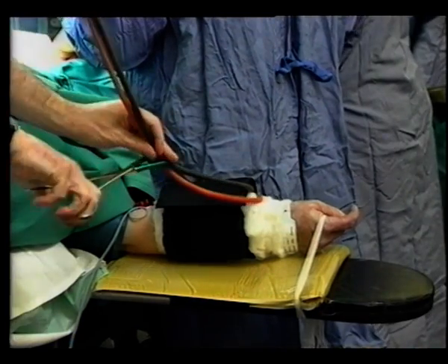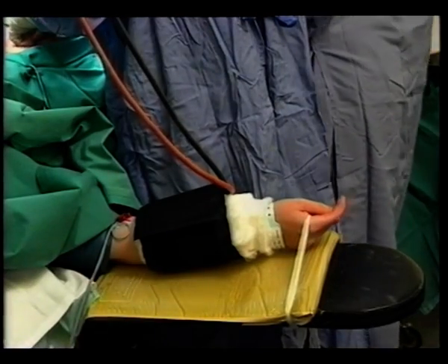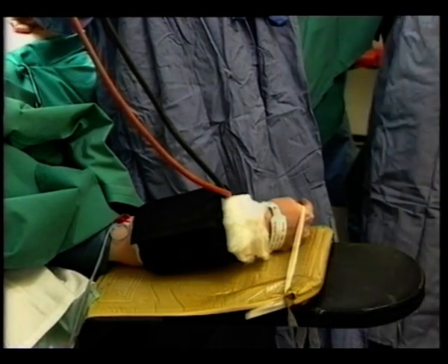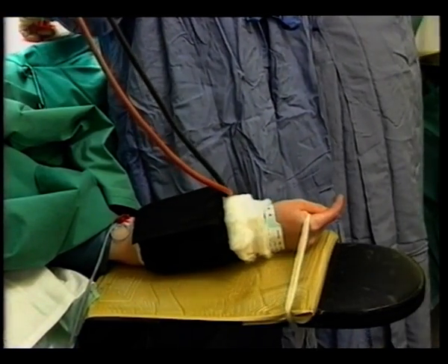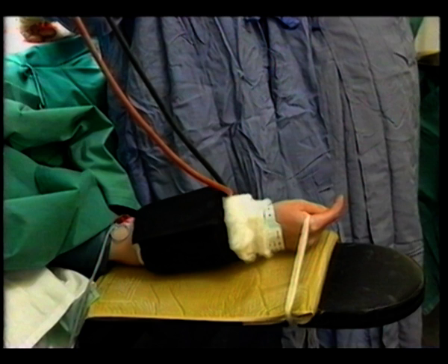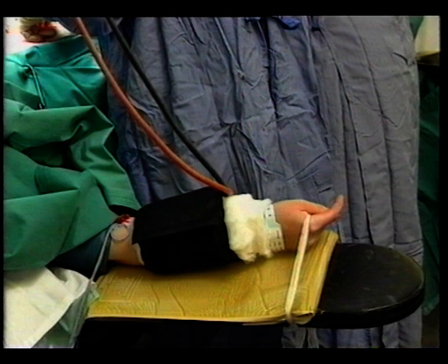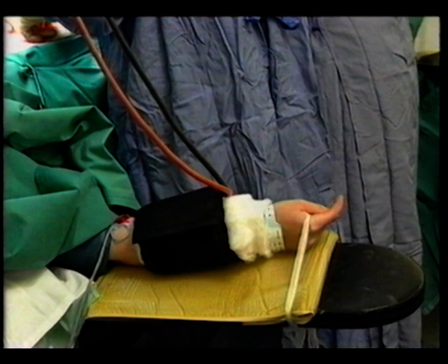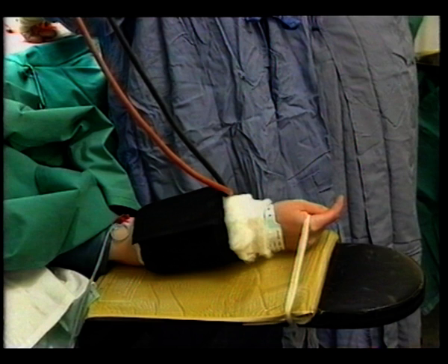After 30 minutes, the tourniquet is released and the integrity of the ulnar and median nerves is again checked using train of four stimulation. The tourniquet can be maintained for up to 30 minutes and then deflated until further muscle relaxant is required. Once again, the integrity of the ulnar and median nerves is checked with the nerve stimulator and a further 30-minute period of forearm occlusion begins. This cycle may be repeated for as long as surgery continues. If surgical circumstances make access to either arm problematic, consider using a leg and foot instead.